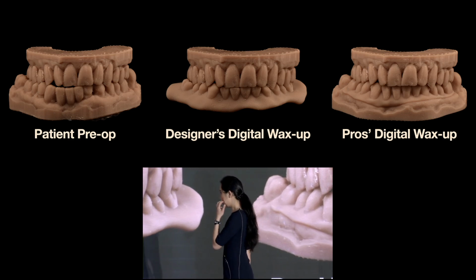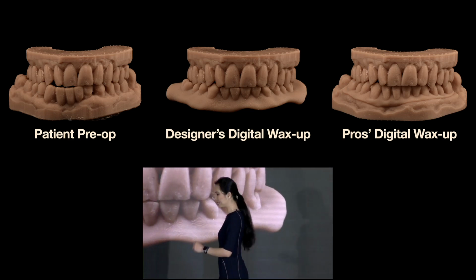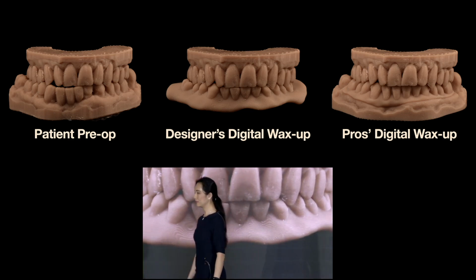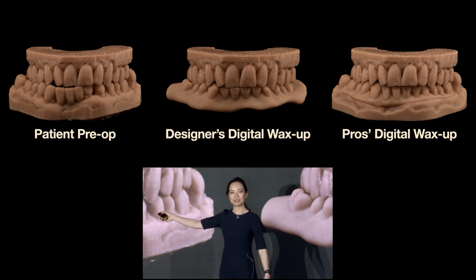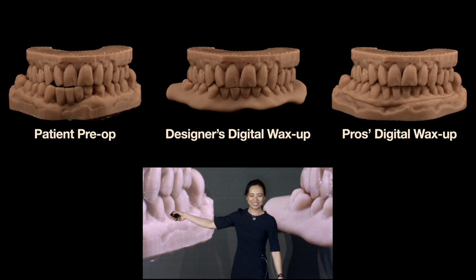So just for fun, I did a design challenge with the technician just to see where things should go, because this is how the patient started. I'm not sure why the occlusion looks like this. I have nothing to do with this pre-op.